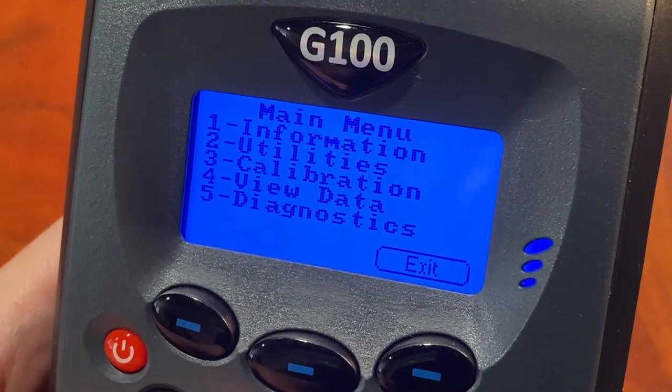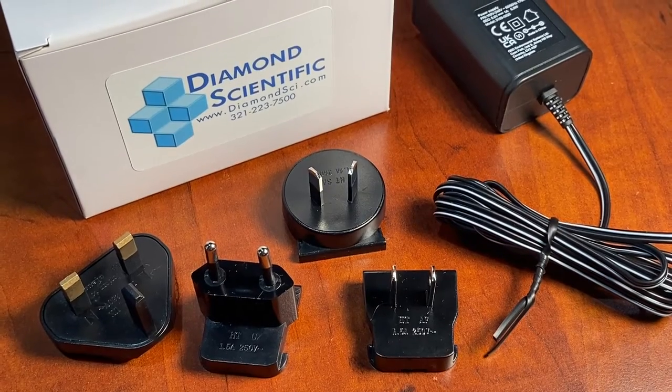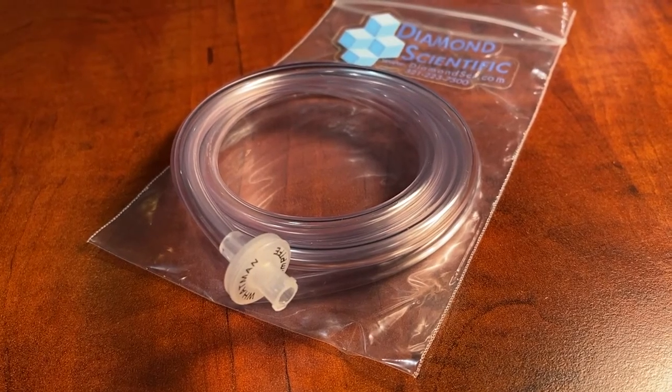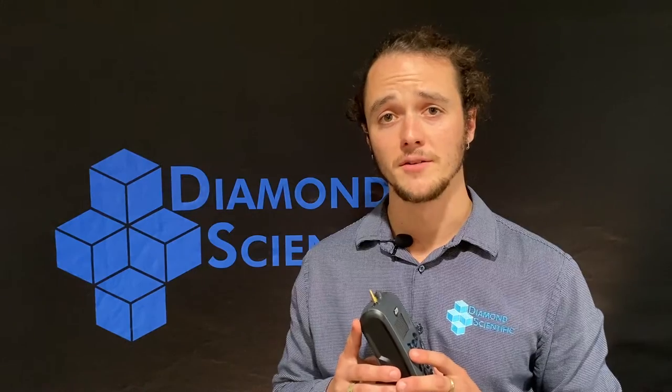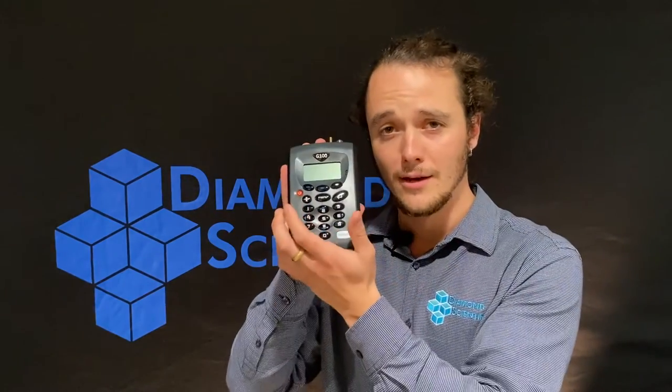Additional options include data storage and download capabilities. While those features may be optional, every Via Sensor comes with a universal power supply and adapters, as well as a filter and tubing kit. And lastly, my personal favorite feature — the kickstand.